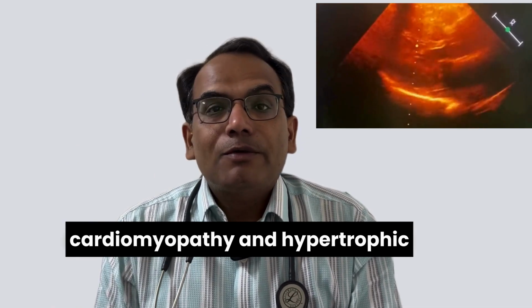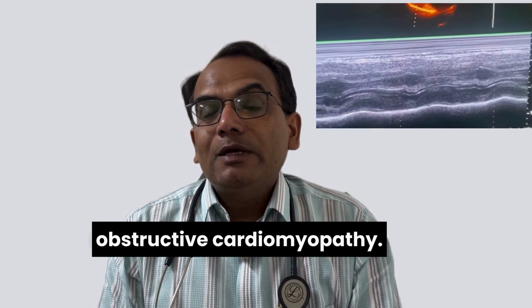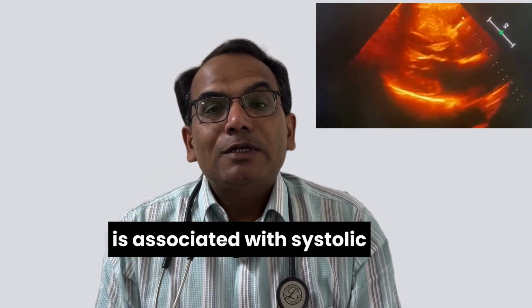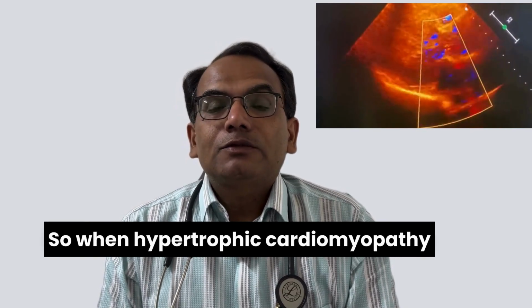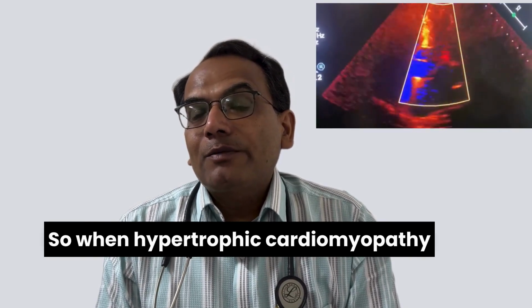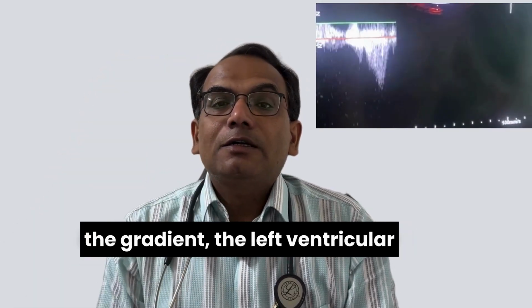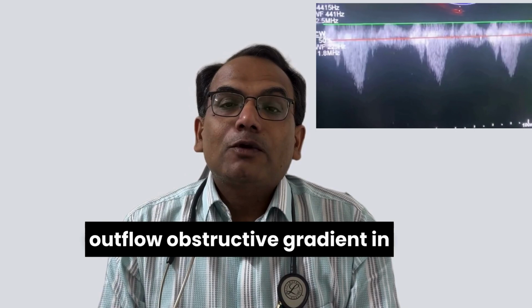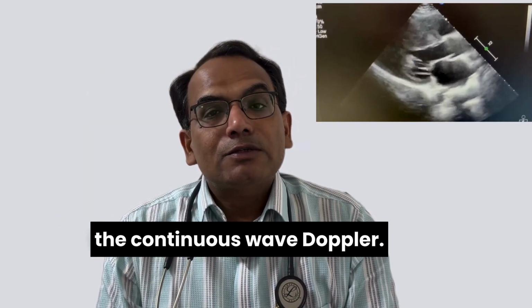hypertrophic cardiomyopathy. And it is hypertrophic obstructive cardiomyopathy when hypertrophic cardiomyopathy is associated with systolic anterior motion of the mitral valve. So when hypertrophic cardiomyopathy is associated with SAM, we can see the left ventricular outflow tract obstructive gradient in the pulsed and continuous wave Doppler.